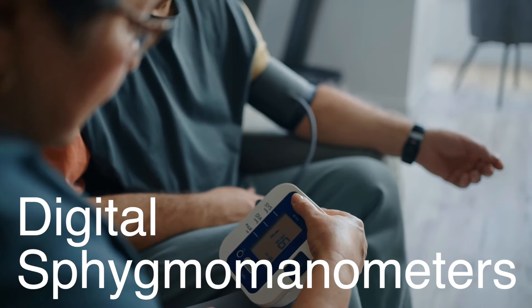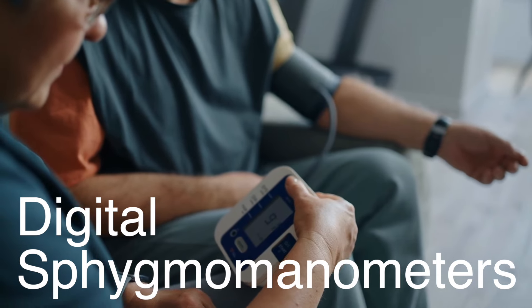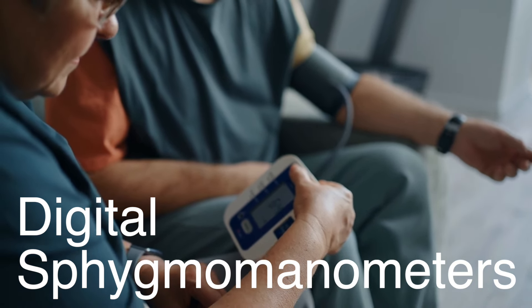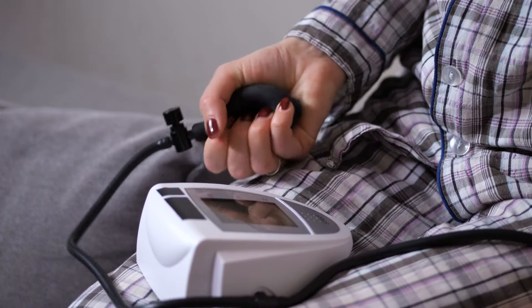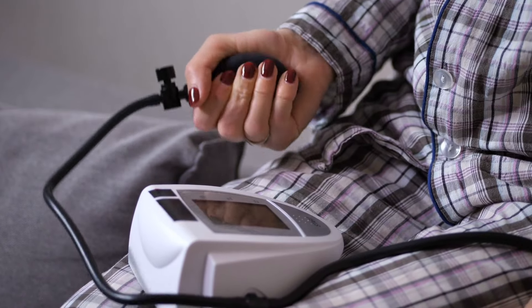Digital sphygmomanometers, which became popular in the latter part of the 20th century, further streamlined the process. These devices automatically inflate the cuff, listen for the Korotkov sounds electronically, and give you a quick readout. They're incredibly useful for people monitoring their blood pressure at home.